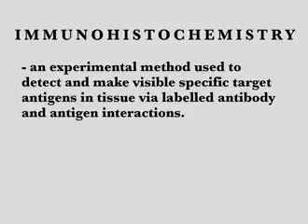Immunohistochemistry is an experimental method used to detect and make visible specific target antigens in tissue via labeled antibody and antigen interactions.